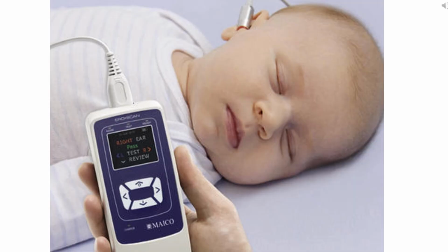So this is the image of an OAE machine. Here we can see the patient is lying down and there is a handheld device in the hand of the examiner, and the ear probe tip is inserted into the ear canal. It will receive the sound energy emitted by the cochlea. It hardly takes 2 to 3 minutes to test both of the ears. So that was all about BERA and OAE.